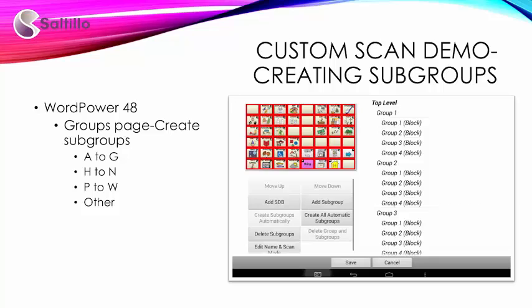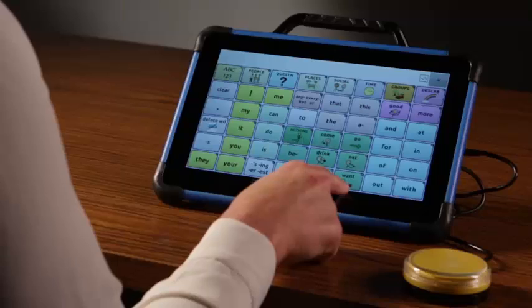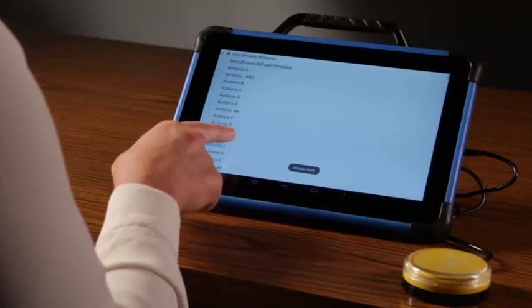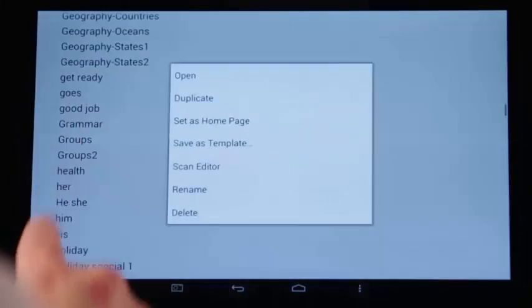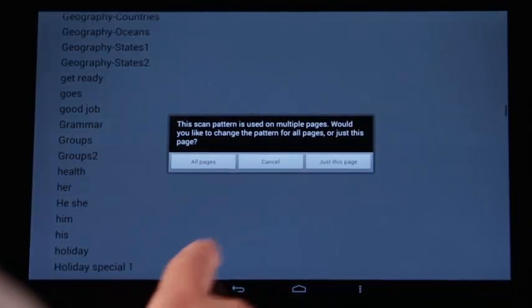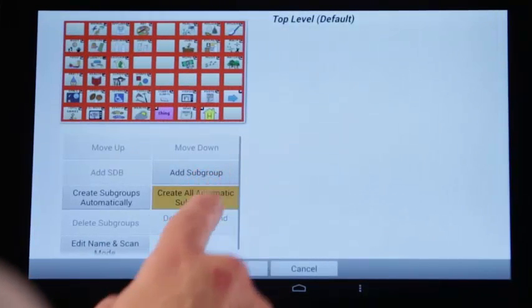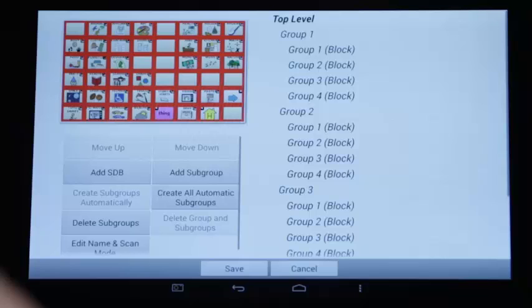The custom scan can also be set to scan the initial blocks with auditory prompts and then continue the block scan and auditory prompts within the block. To do this, I will create all subgroups. I am continuing to use WordPower 48, one switch, a block scan, and auditory prompts set to label. Now I need to access the scan editor. For this example, I will create all automatic subgroups. The system will create the top level groups and automatically create the subgroups with the block pattern. Again, I will create meaningful new labels for the blocks in both the top group and the subgroup.